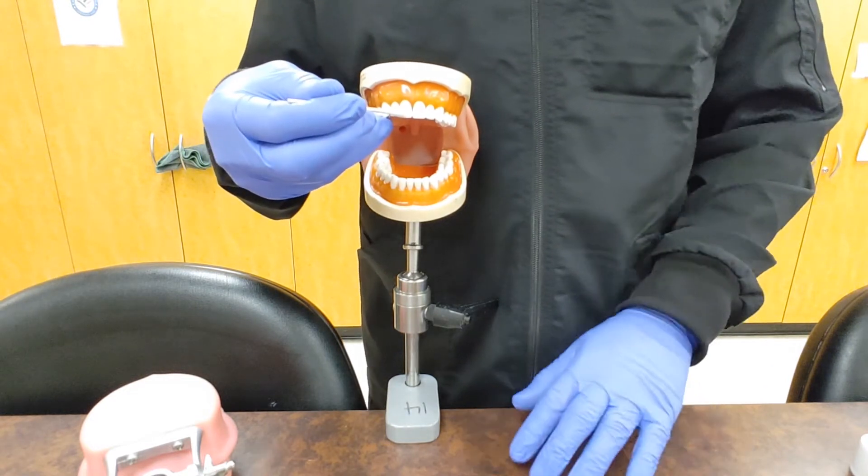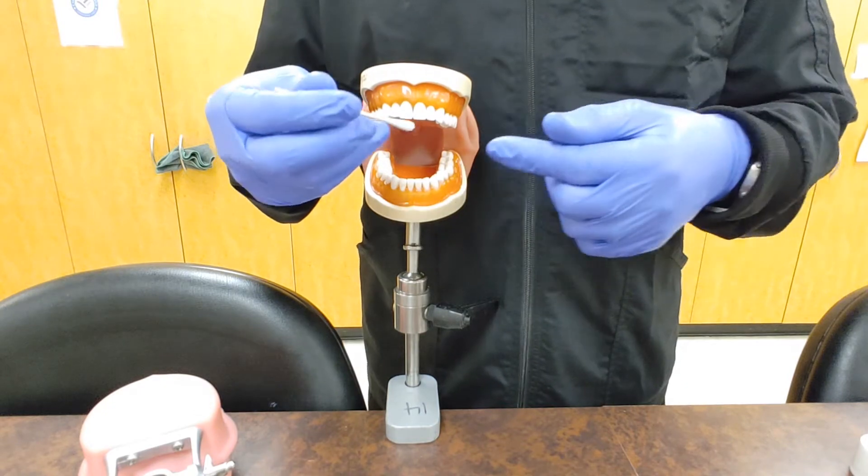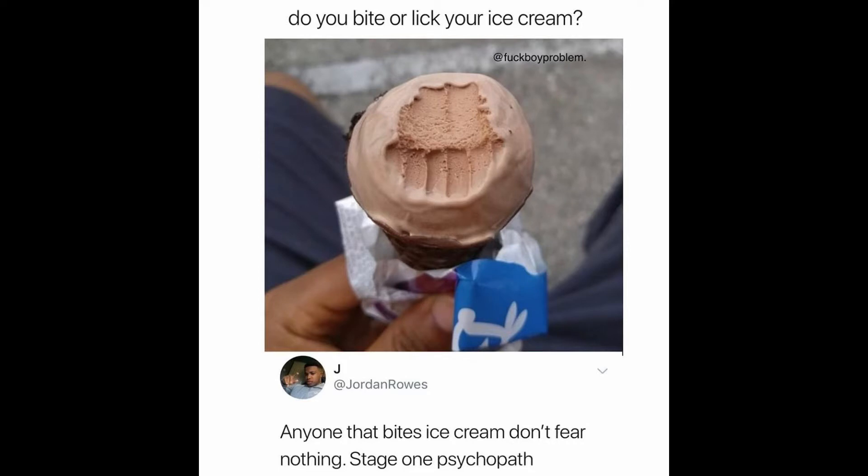Be sure to well inform your patient what you're doing and how you want them to respond to the stimuli — either by raising their hand, a nod, or pulling away. Record that information on the chart and continue to the next piece. Just know that some patients can have a really high tolerance to these types of pain stimuli, just like those people that bite down straight into ice cream without batting an eye.